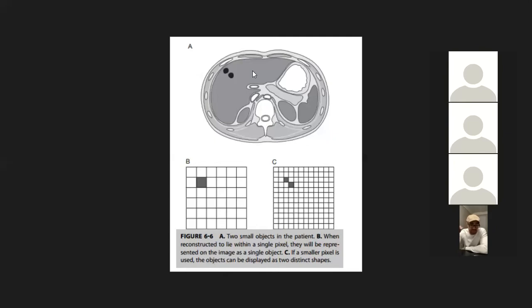If you go back to your book with the MTF, that function talks about how systems have a limiting spatial resolution. We want systems that can show the body true to life, and it's our job as technologists to set up protocols that minimize dose while maximizing visibility.